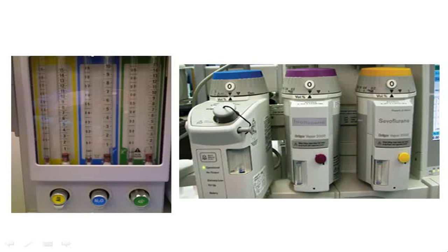Okay. And so, my mic's not on. No wonder. And then on the right, of course, you know that I'm going to put it on a percent. And if percent's on the dial, then MAC is in your mind, right? You have to do that calculation. And on the Thorpe tubes, what's the only one that gives you a MAC value? Nitrous. The nitrous, right? Excellent.